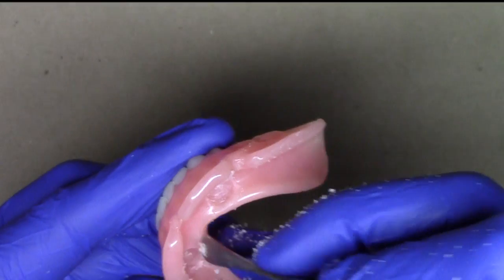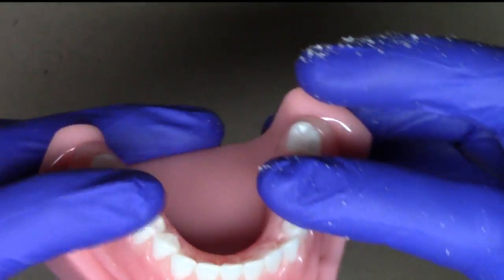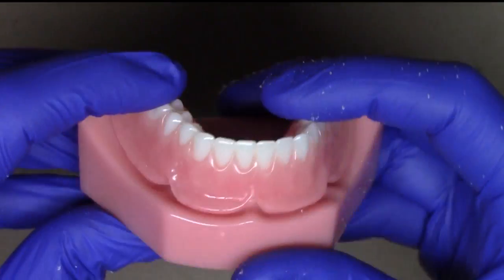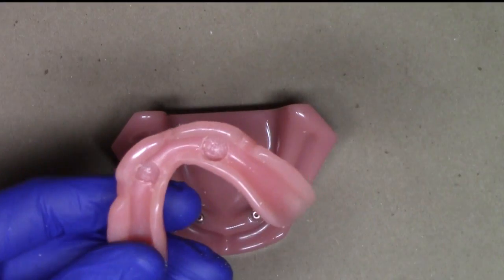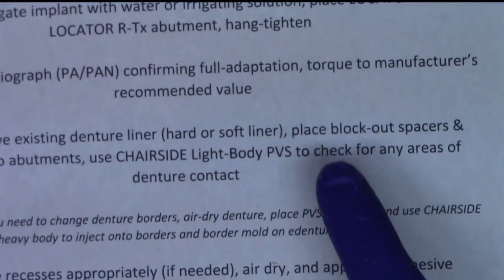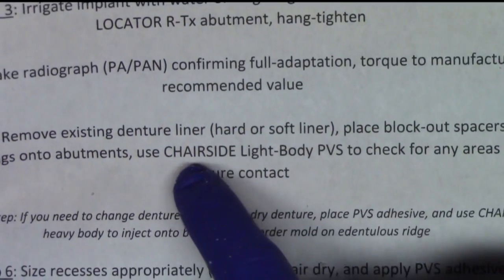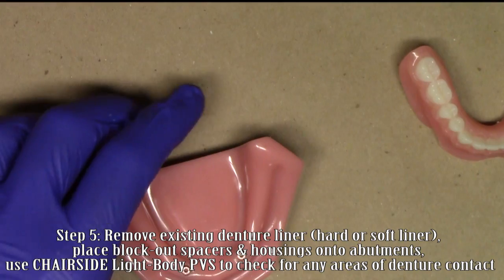Now I've got it pretty well cleaned off. I'm going to take this and just place it lightly onto my patient's ridge, verifying that it feels like I'm not contacting anywhere. Most of the time when you have a lot of soft liner, you don't need to do too many adjustments after removing it. So after doing so, we're going to place our block-out spacers and our housings onto the abutments, and I like to check the fit of the denture using my chairside light body PVS to check for any areas of contact.